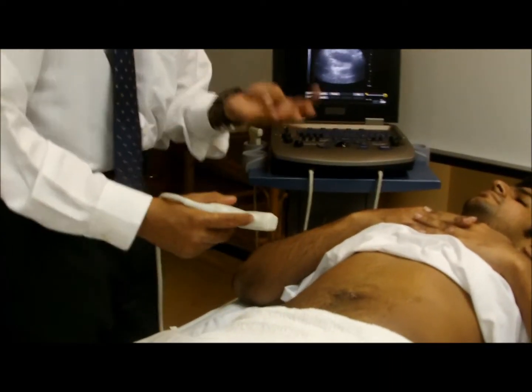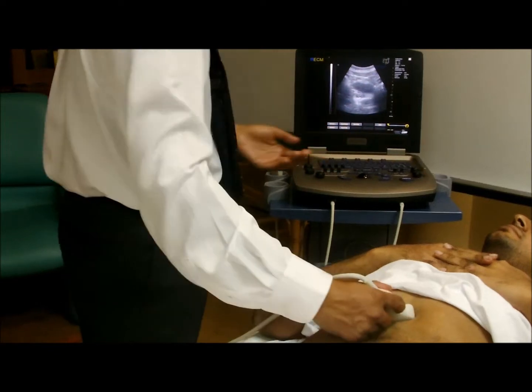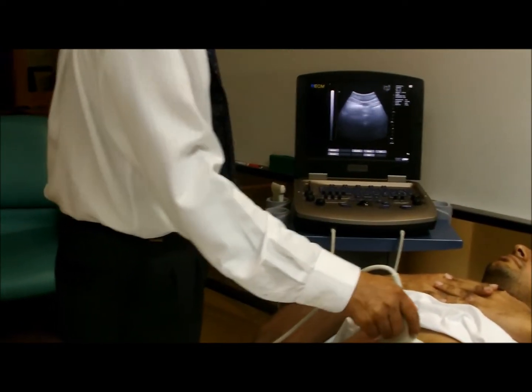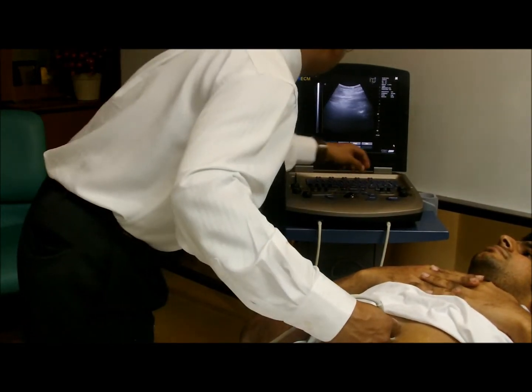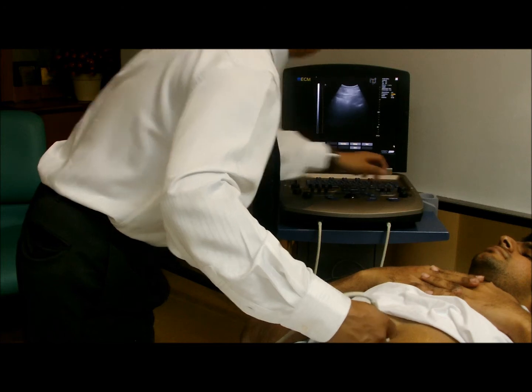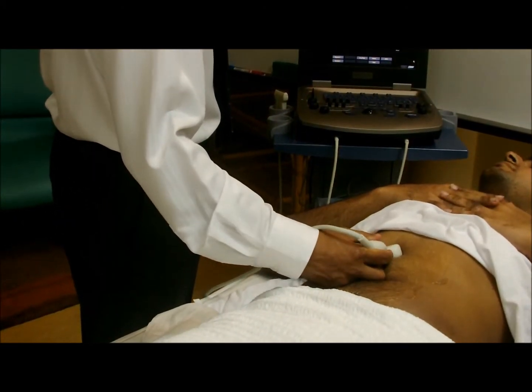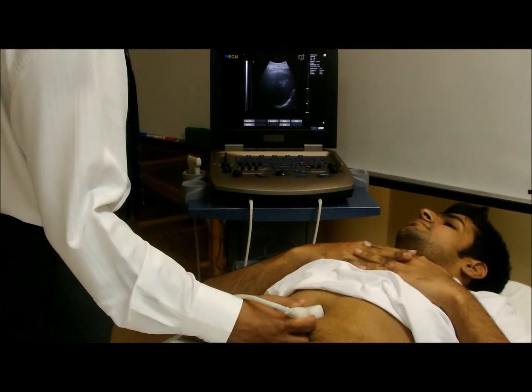And along the way, you'll be able to look at the liver and you'll be able to find gallbladder as well. So let's try it. Okay? So when I do it from here, from the epigastric area, I move this side and I start to explore. Increase a little bit. Okay. So I'm coming here, and sometimes your view may be obscured by bowel shadow, and you will be able to explore.